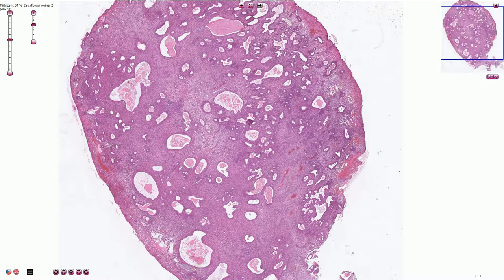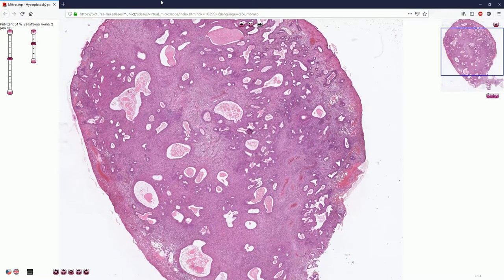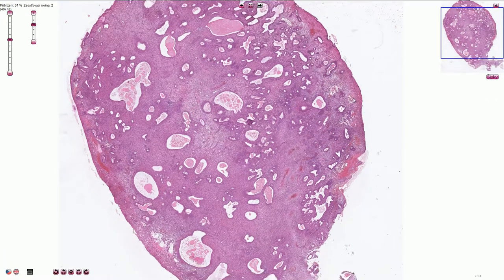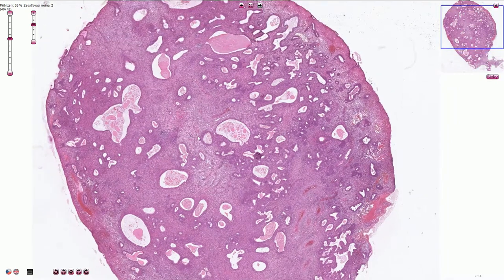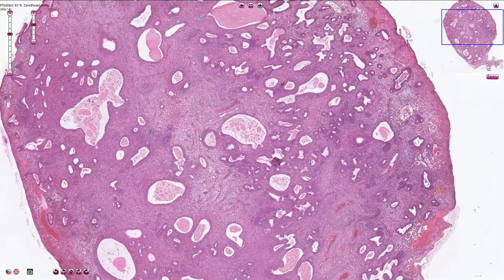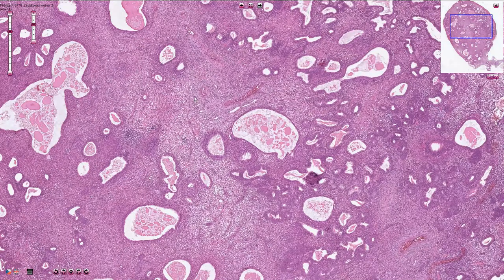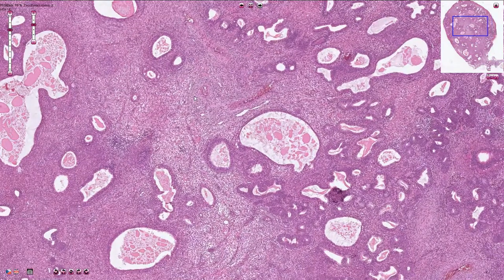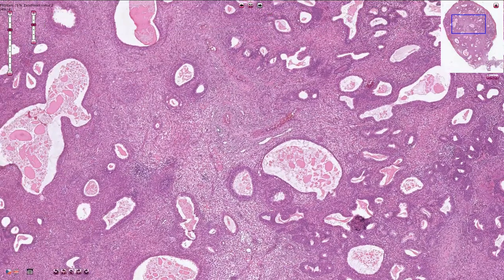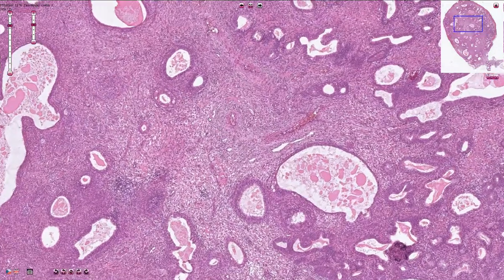Under the microscope we can appreciate a polypoid lesion. That means we need to see at least three sides lined by superficial epithelium, and inside of the polyp we usually see endometrial stroma which is slightly more fibrotic and has a slightly different appearance than normal endometrial stroma.